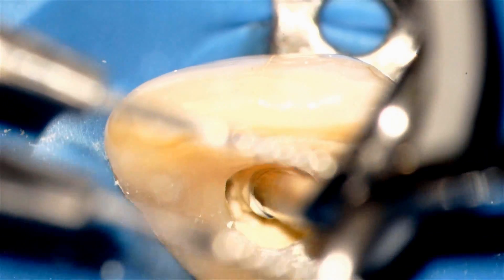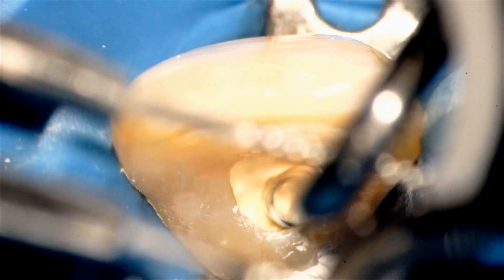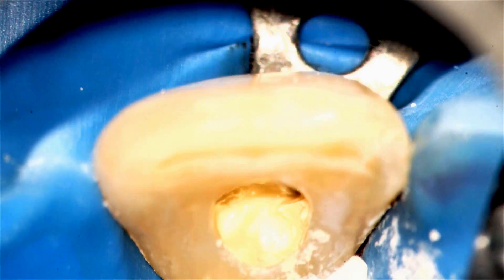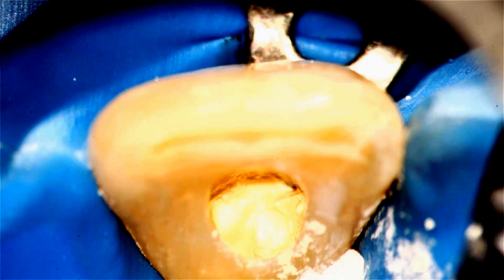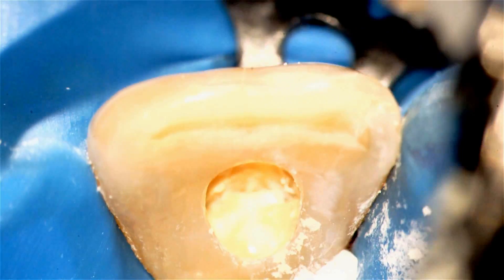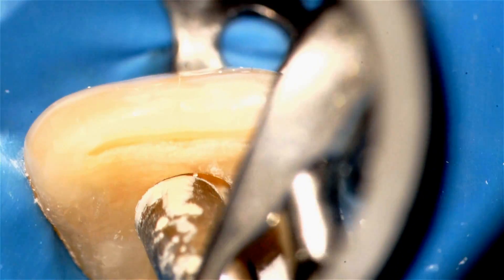Now I'm placing a little bit more to compress it, 12 plugger in this case, pressing it down. Again, having my assistant place ultrasonic at a right angle to the plugger, activate it, and it just causes the chunky Biodentine to become solubilized and it flows. There we go.